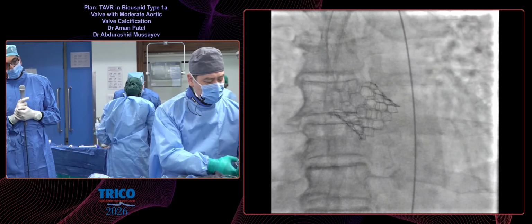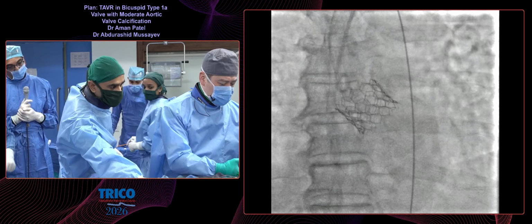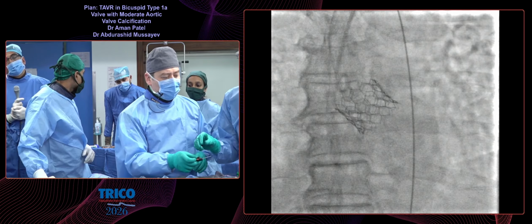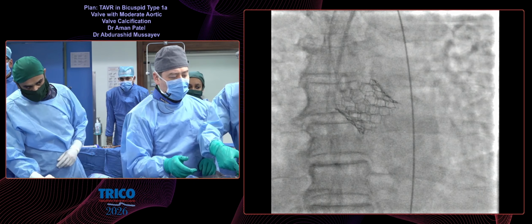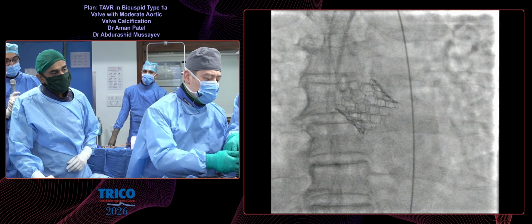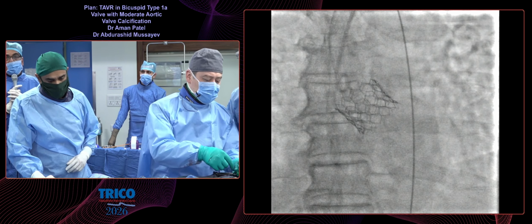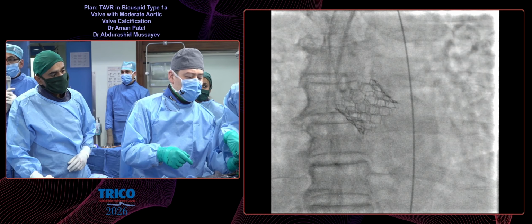Is there a difference in femoral complication rates if you reverse versus if you don't reverse, or if you use protamine versus don't? Do you think there is any data regarding that? Actually, I am not aware. I don't think anybody has studied that, to my knowledge. Rajiv, do you know anything? You guys are very academic and try to answer every question in the most detail. Oh, no, I agree with everyone. I don't think there's data. It's just a difference in practice.